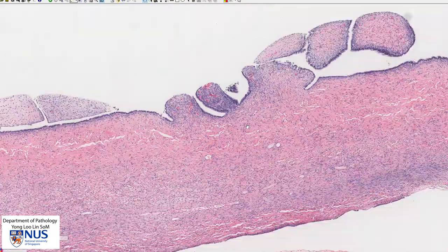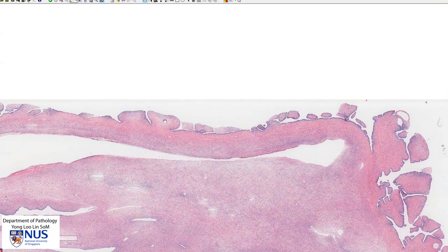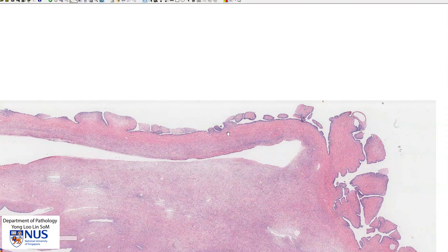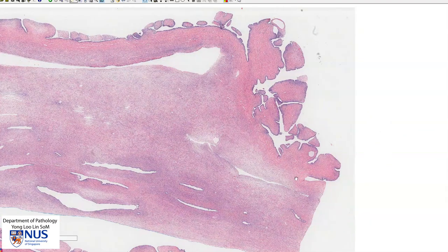Usually in serous cyst adenomas we do not see very complex branching papillary structures, and we also do not see multi-layering of the epithelium. Usually it is unilayered or monolayered, and the epithelial cells are very bland.